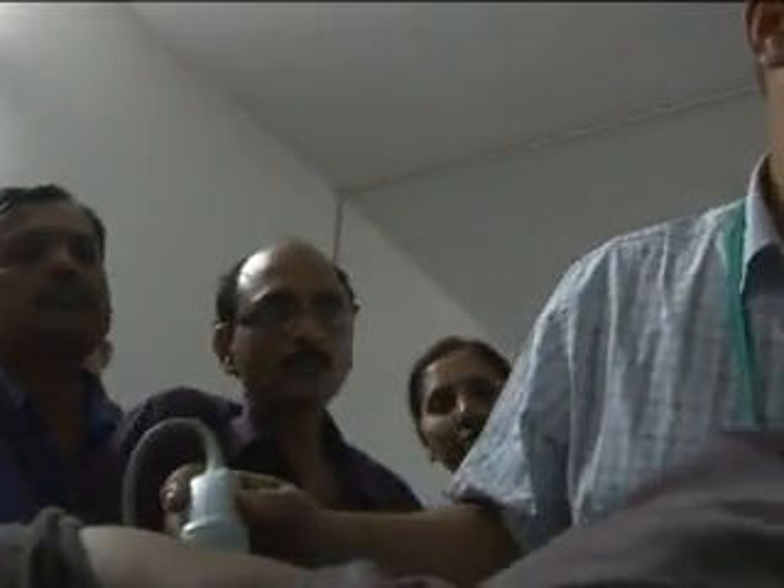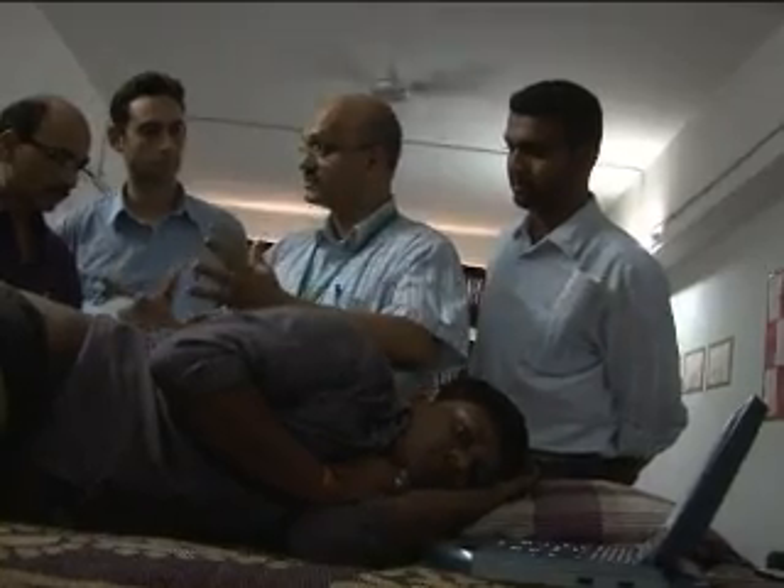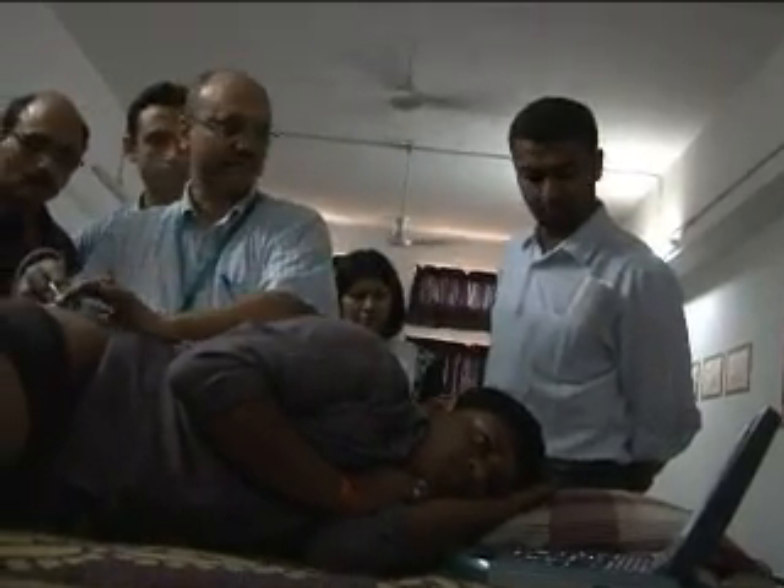The sacrum will be the end of the sacrum. The first thing I'm going to do is find my ilium bone. You see this line — here's the ilium right there, and this is the ilium bone. This side of the pelvis is what we are imaging right now.